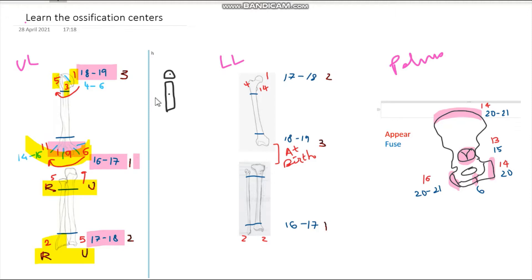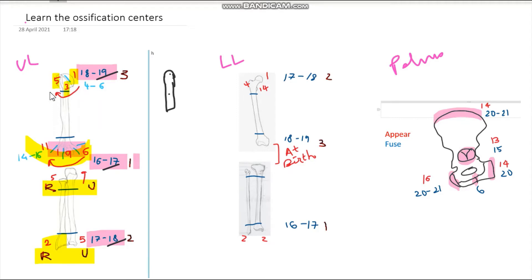Yes — that gap means they haven't yet fused. Once there's no gap in between, that is when they've fused. The ages written in blue are when they fuse: 16-17, 17-18, and finally 18-19. Two more important numbers: the epiphyses 1-5-3 fuse with each other at four to six years of age.